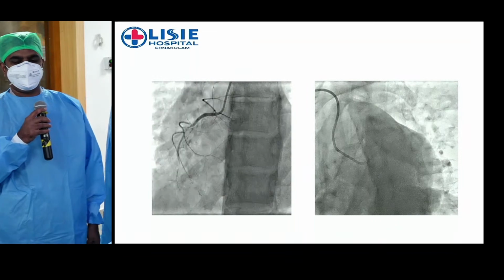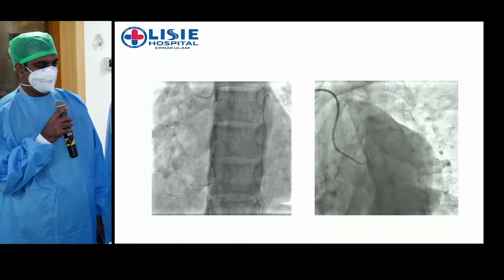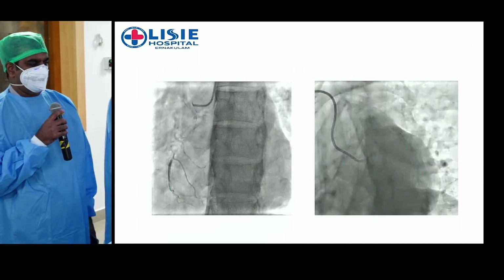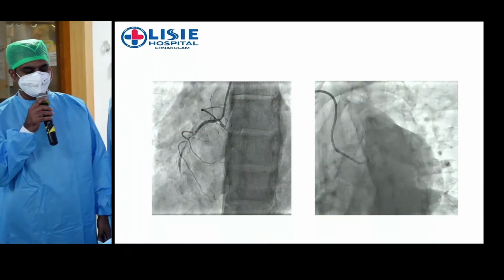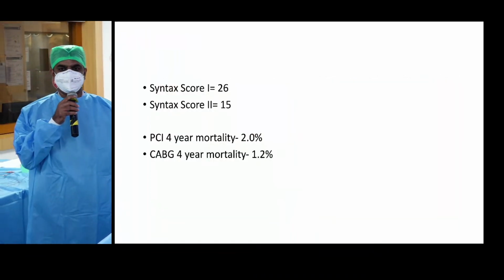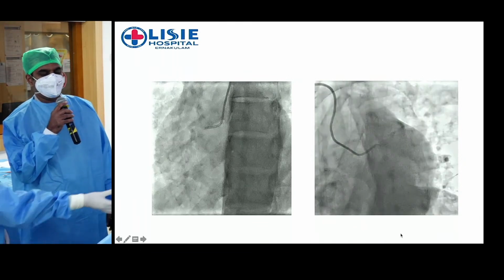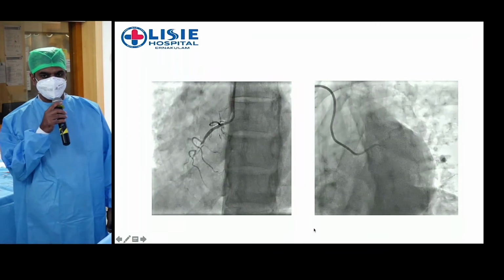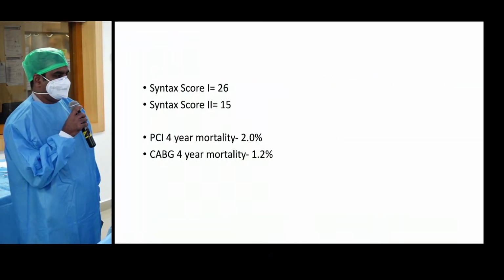This is the coronary angiogram. The angiogram on the right side shows a significant, almost total occlusion with a significant amount of thrombus in the distal aspect of the RCA. The left injection shows the left main has a distal 30% lesion, and in the LAD ostium there is around a 70% lesion in the caudal view. In the cranial view, the PA caudal view, it shows around a 70 to 80% lesion. The circumflex is normal. The rest of the LAD is also normal. Over to Dr. Ronnie for further discussion.